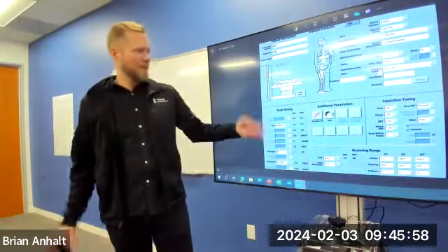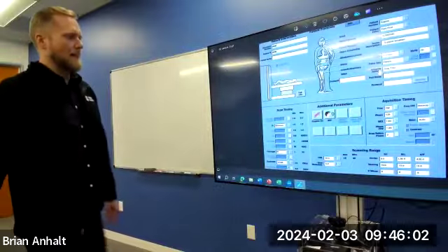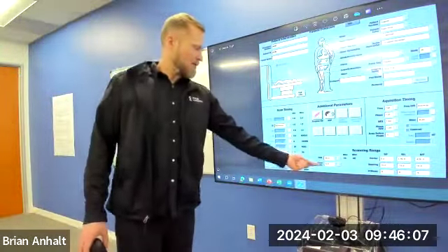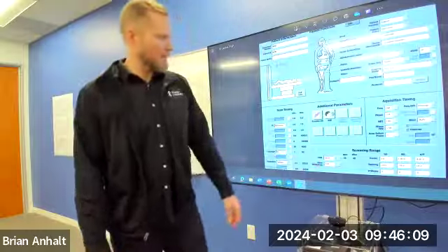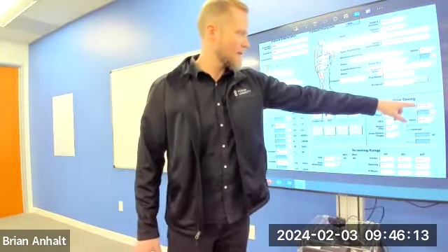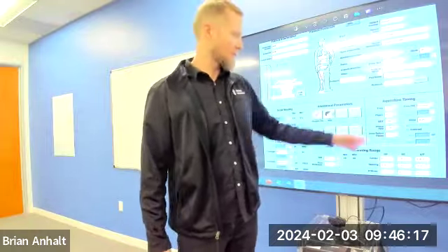Field of view, specifically frequency field of view, is what we're going to be referring to it as, and that's what you're going to see on more modern systems. Slice thickness, we're talking about that as well. Frequency and phase matrix, these are your matrices. Your phase frequency direction.